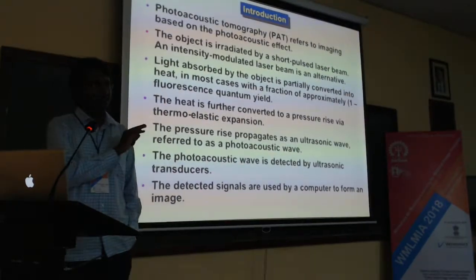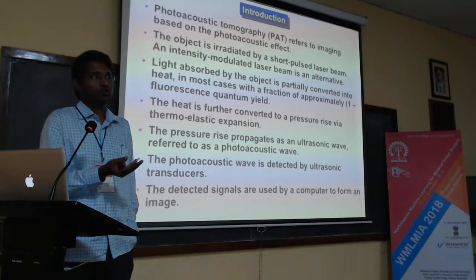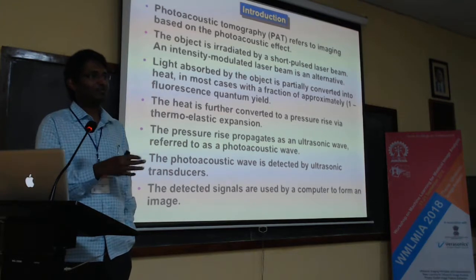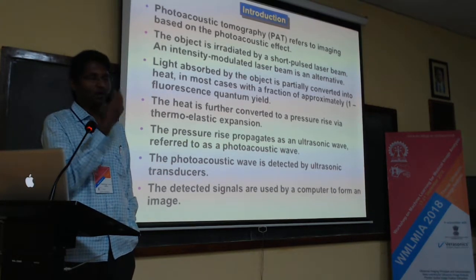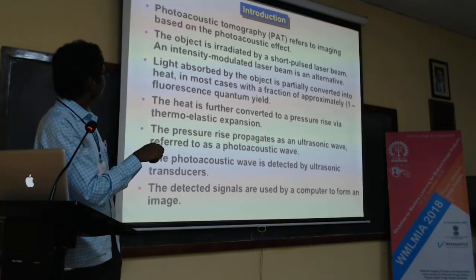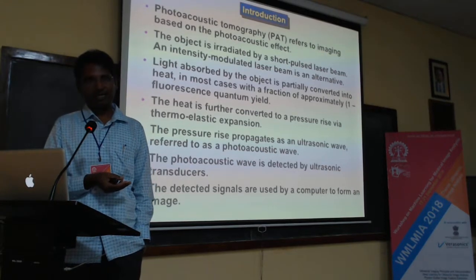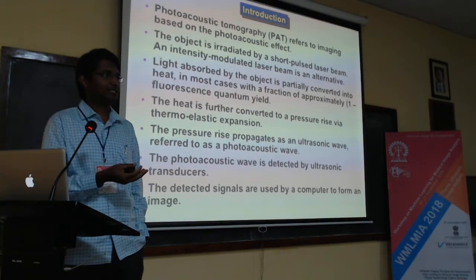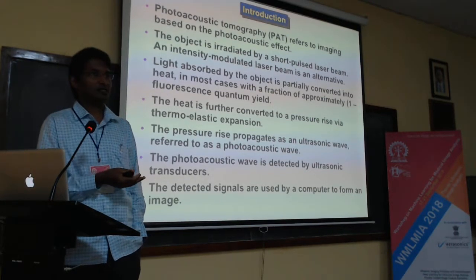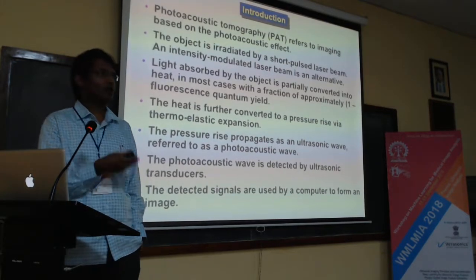This is the whole view which you need to know. If you ask me what is the one slide you should read, I would say this is the slide. It has everything in it, and the rest is mostly about explaining one by one what is happening. We are going to refer to photoacoustic imaging, or photoacoustic tomography, as an imaging modality which takes advantage of the photoacoustic effect. I will go on about what the photoacoustic effect is. Other than the biomedical application, there are other applications which are being used, and I will talk about those as we move along.